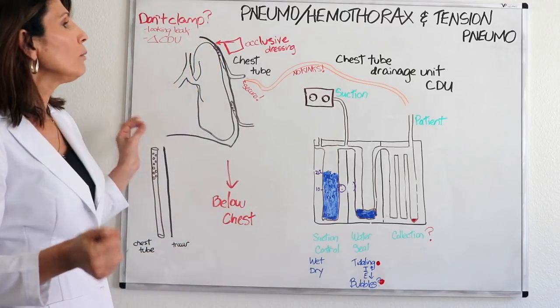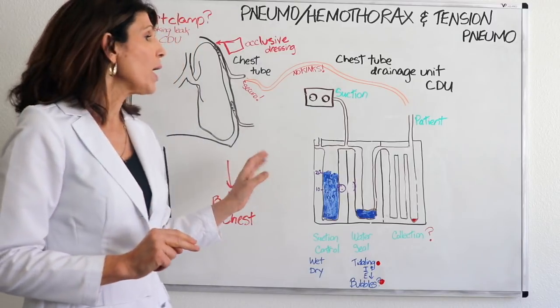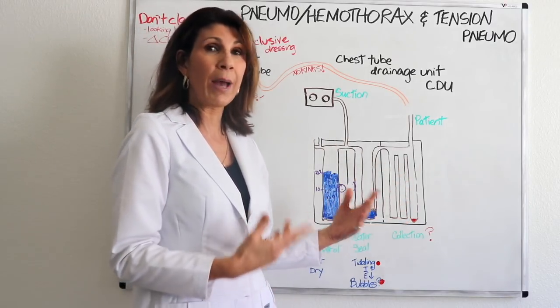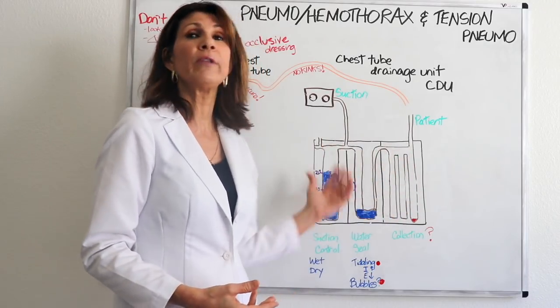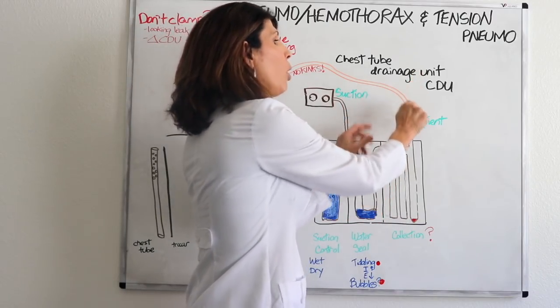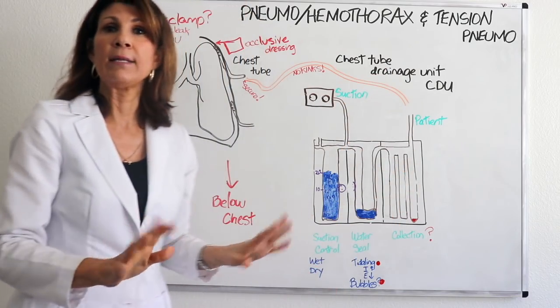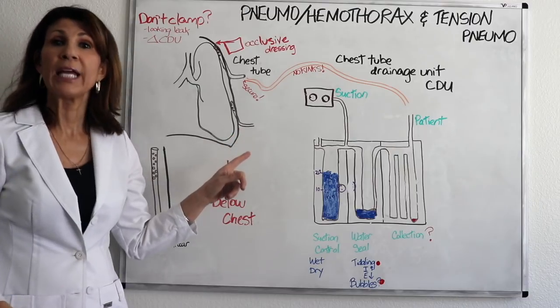And you can hopefully, and sometimes not, figure out where there's a leak, either in the tubing or at the insertion site. The only other time that you would clamp it for a moment is when this gets filled up sometimes, when you're collecting fluid output, blood, and you actually need to change over the chest tube drainage unit. So the tubing is clamped for the moment that it takes to change over the connections, and that's it.